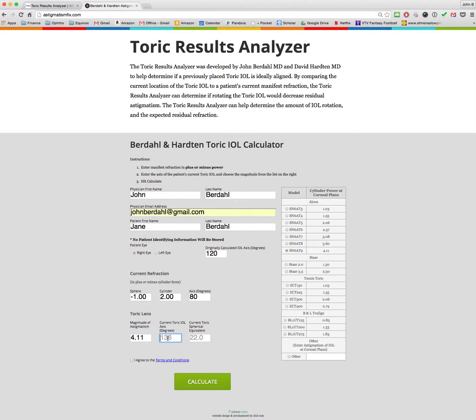Then you need to measure in the office what location the lens is currently at. The best way to do this is to use an app like Toric Pro or Axis Assistant — take a slit beam, place it on your slit lamp right on the dots of the astigmatism IOL, pull your slit lamp backwards, and use your iPhone or smartphone to measure the exact axis with one of those apps. Enter that information here. It's also helpful to enter the spherical power of the IOL — in this case, a 22-diopter SN6AT9.